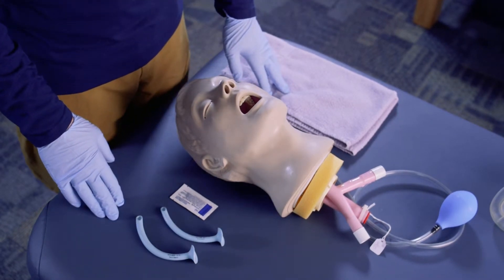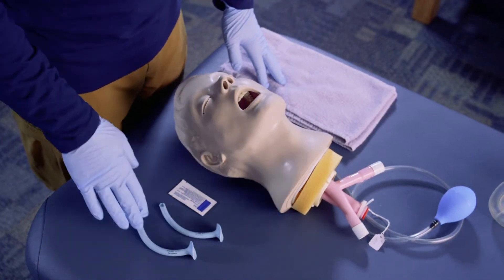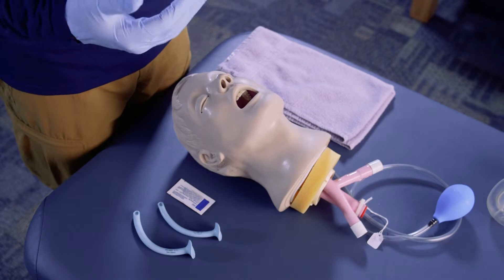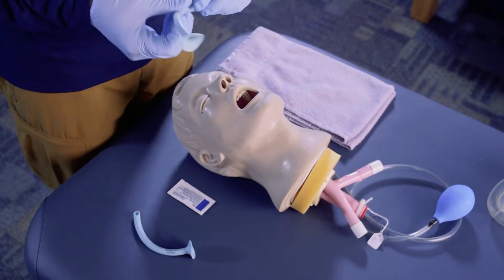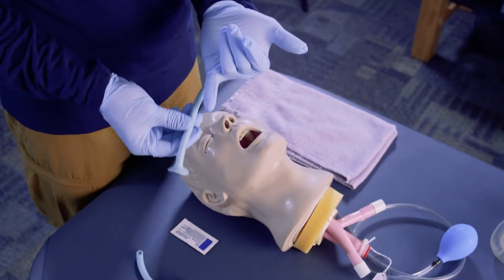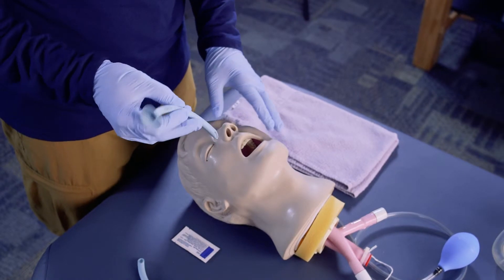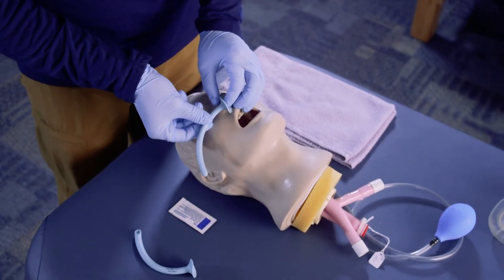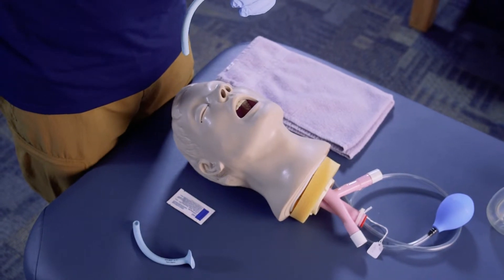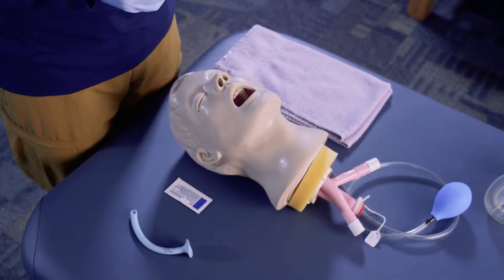Next, we want to select the appropriate size of NPA. There are different sizes depending on the size of the individual — they're generally sized to height. You also want to make sure it fits into the nostril; the diameter of your pinky provides a good size reference. Another sizing method is to measure from the tip of the nose down to the earlobe, which gives the correct length to reach beyond the tongue so air can get to the right spot.